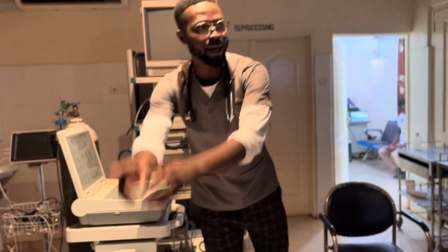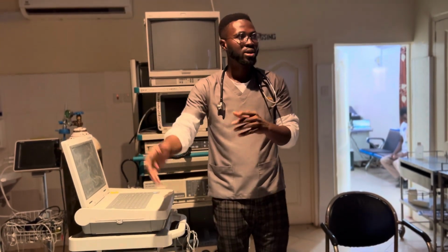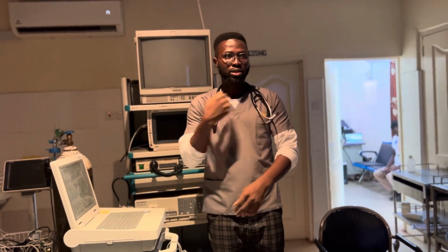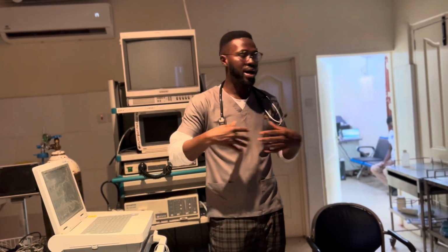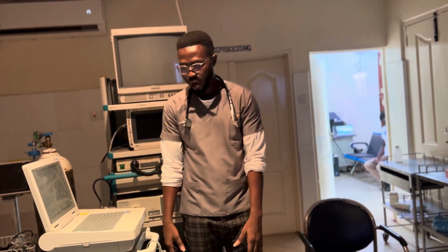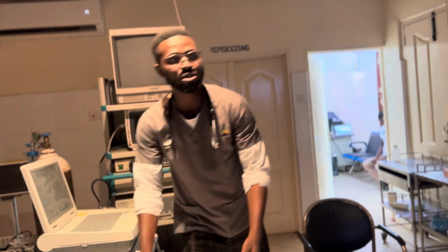Then you create Einthoven's triangle. And you know the theory, how the leads are generated. Lead 1, lead 2, lead 3, like that. And aVF, aVL and aVR are actually augmented leads, isn't it? So after the limb electrodes, we come to the chest electrodes.